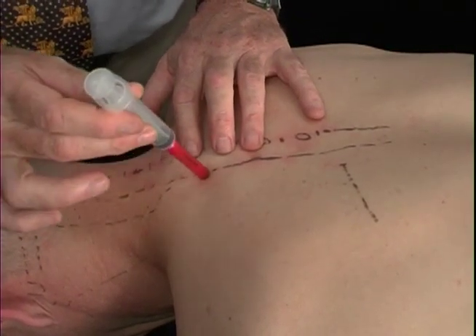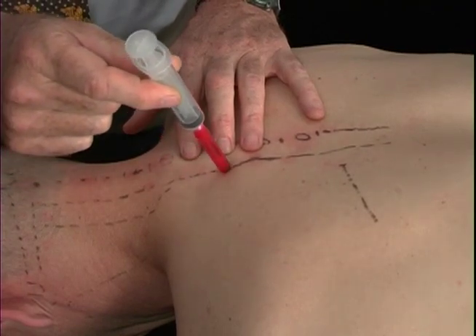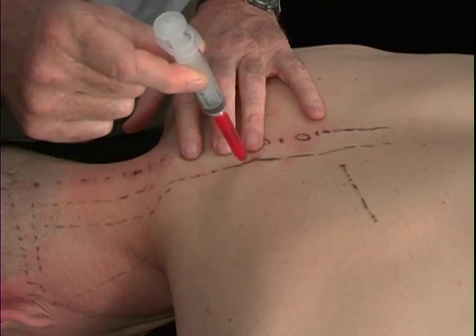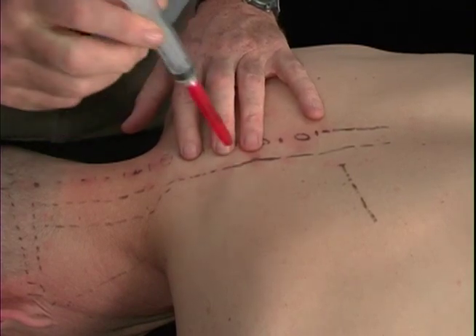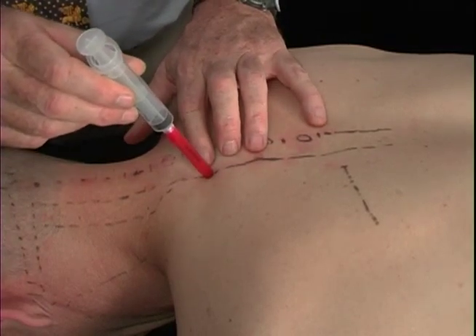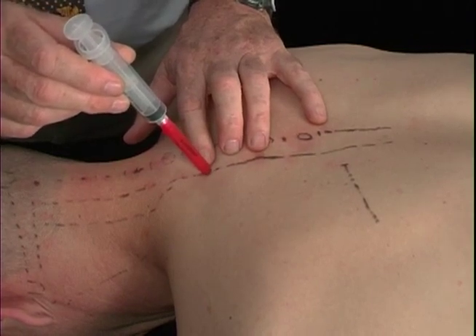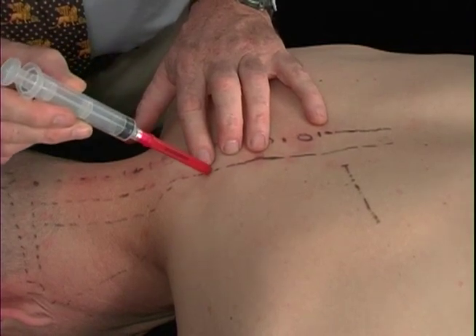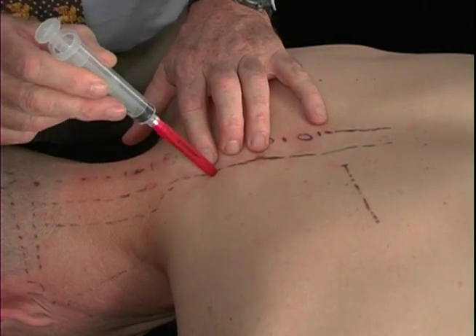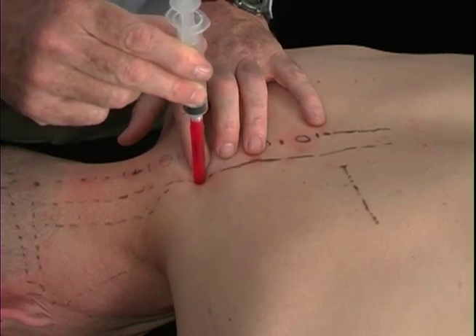We can come in and do an injection, come totally out with the needle, move down a centimeter or so, do another injection, totally out with the needle, move down another centimeter, do another injection. Or we can do an injection here, then come out to the skin line, again not out of the skin but out of the fascia, redirect our needle 10 to 15 degrees and go back in, and then come back out to the skin line, redirect our needle and go back in again.